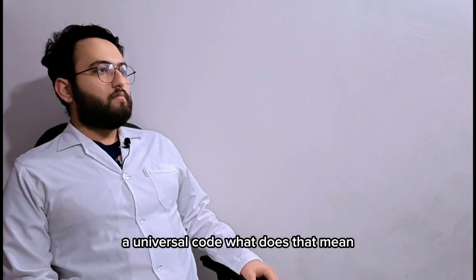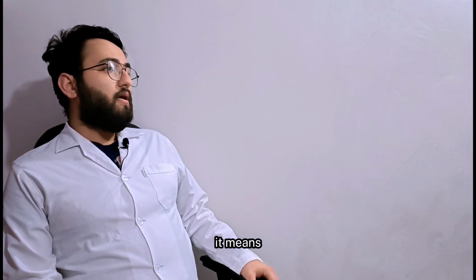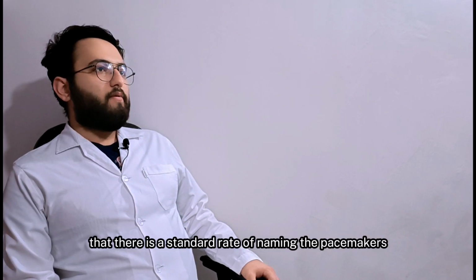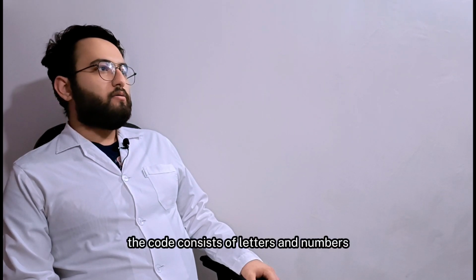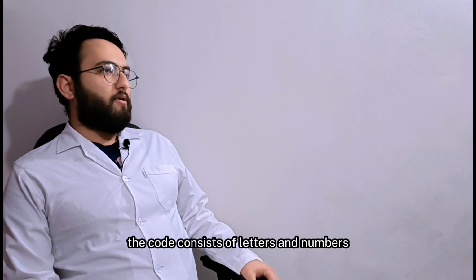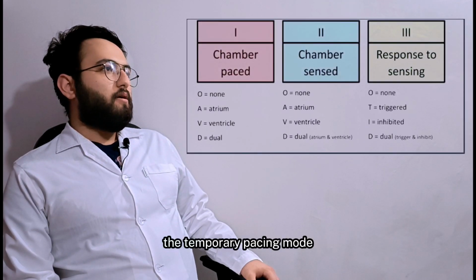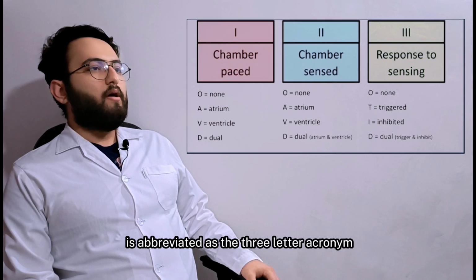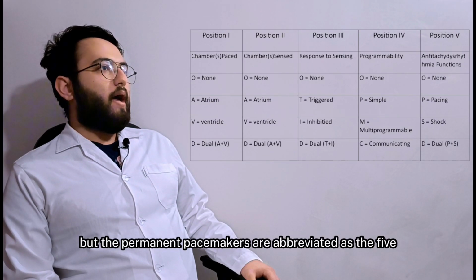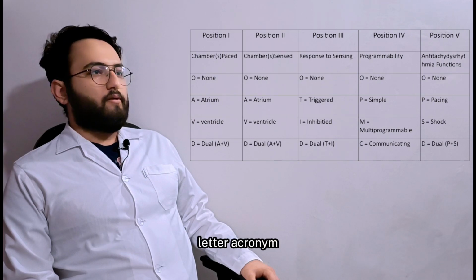A universal code. What does that mean? It means that there is a standard way of naming the pacemakers based on their characteristics. The code consists of letters and numbers. The temporary pacing mode is abbreviated as the three-letter acronym, but the permanent pacemakers are abbreviated as the five-letter acronym.